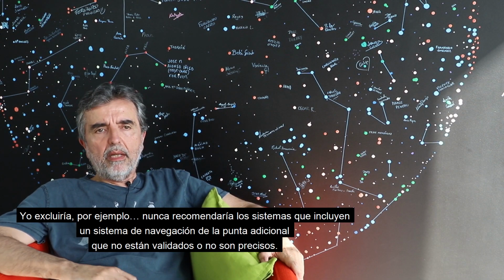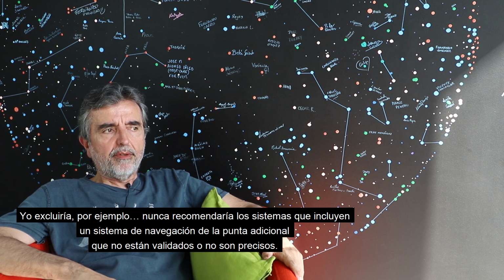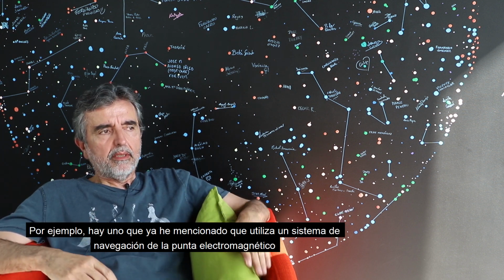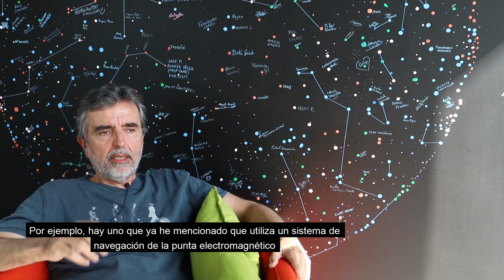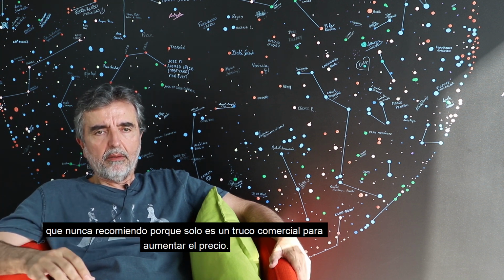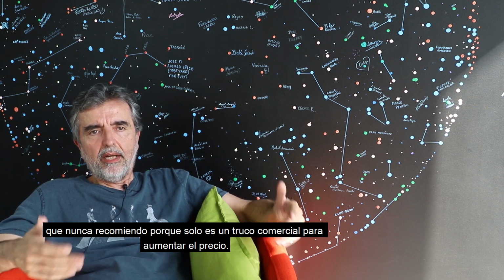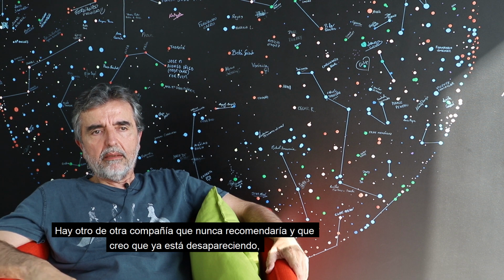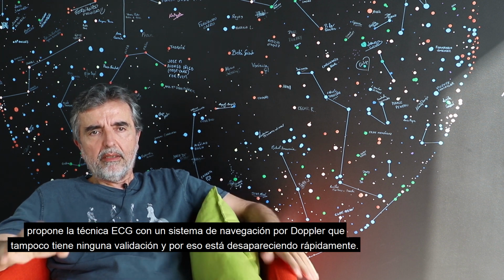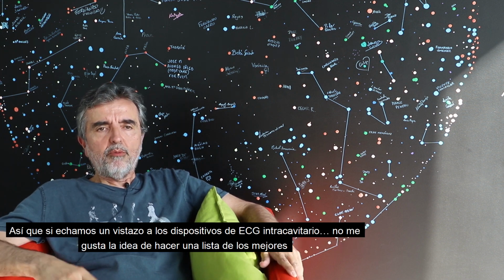Well, I tell you that I would exclude, for instance, and I never recommend those systems which have additional tip navigation systems which are not validated or not accurate. For instance, there is one which I already mentioned, with an EKG technique for tip location, an electromagnetic system for tip navigation, which I never recommend because I think it's just a commercial trick for raising the price. Another which I will never recommend, but now it's disappearing, I think, is from another company. It's an EKG technique with a Doppler tip navigation system, which also has no validation at all, and it's rapidly disappearing.